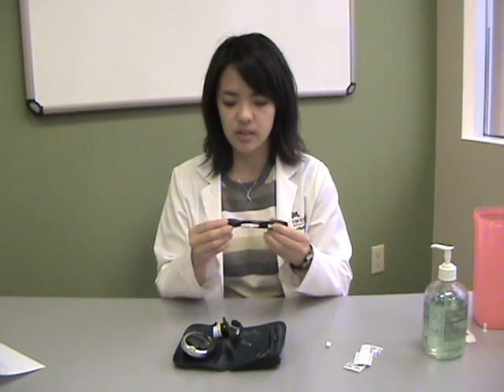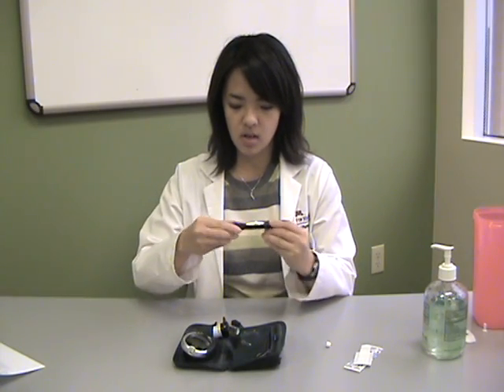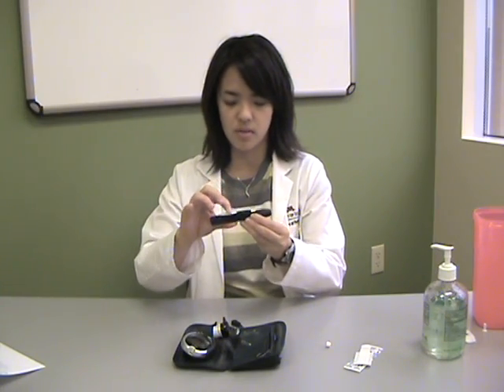You will set the level of puncture on the lancet. There's a dial at the end — you'll want to dial it to the middle. Some devices may have numbers; you'll want to dial it to four. Next, you'll want to activate the lancet by pulling the trigger back. And now your lancet is ready for puncture.